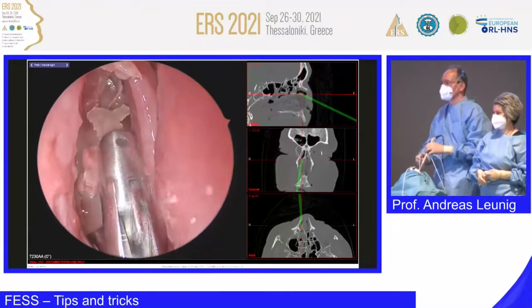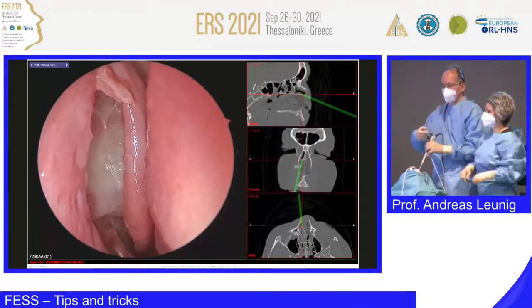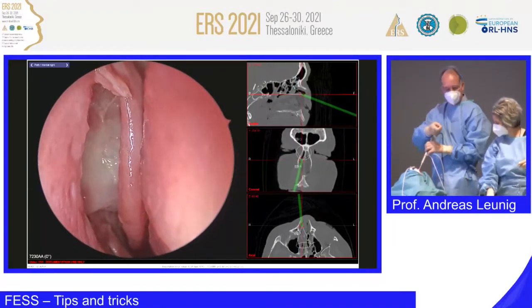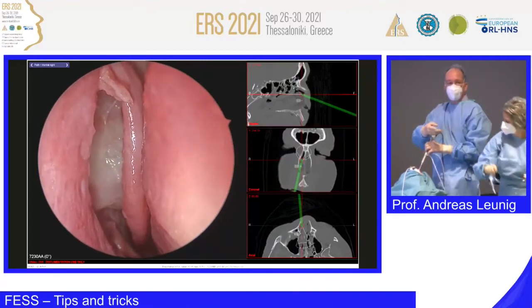That's very important. I was just thinking in particular that you've got a beautifully sharp sickle knife there. The majority of sickle knives on surgical sets tend to be rather blunt.